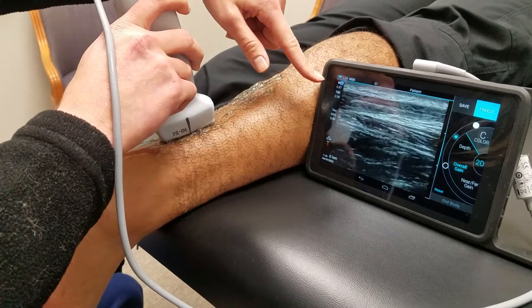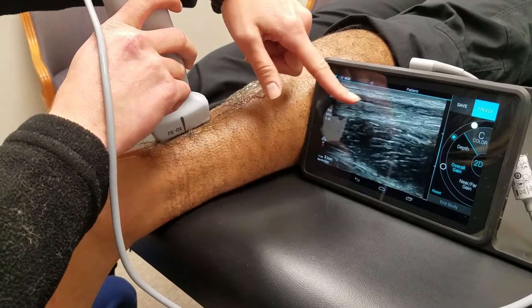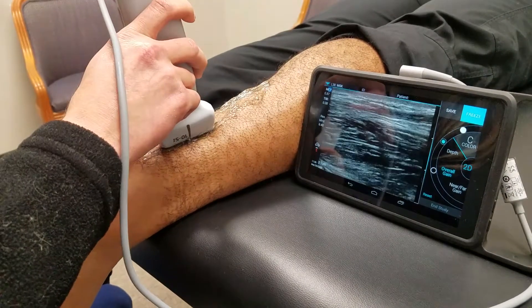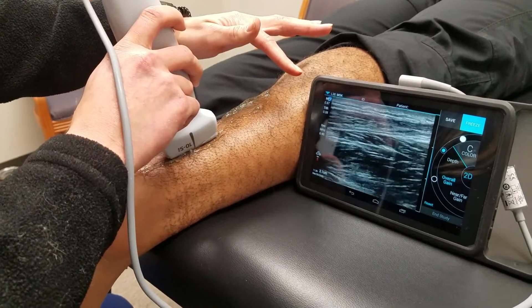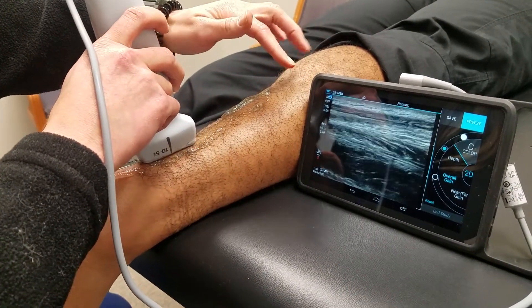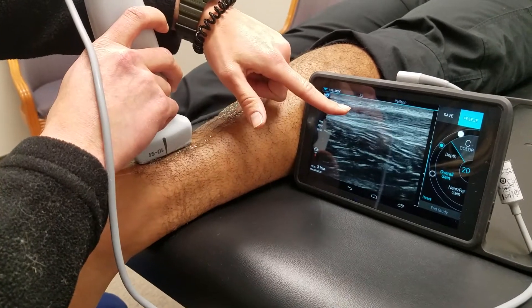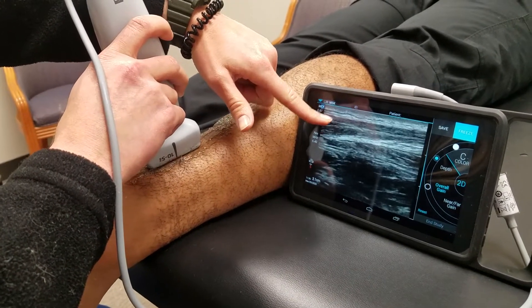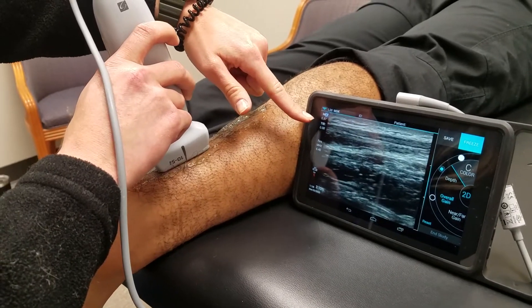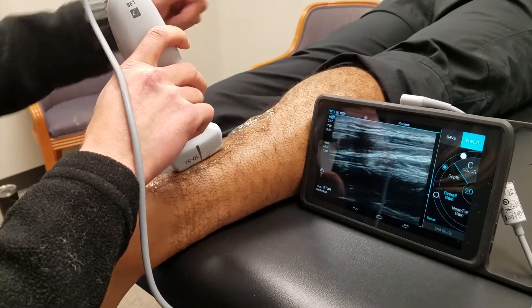Right around here the tendon starts to join into the muscle part — the muscle belly part. This is called the musculotendinous junction. You can see the tendon is right around here, but then it starts to kind of splay out to where there's more muscle involved. That's where the tendon meets the muscle: the musculotendinous junction.